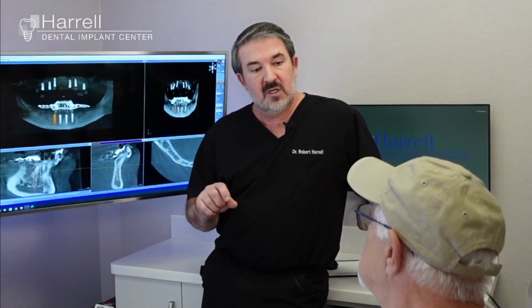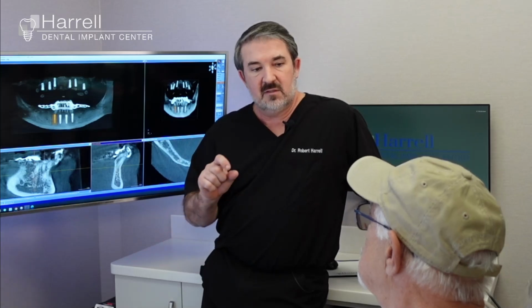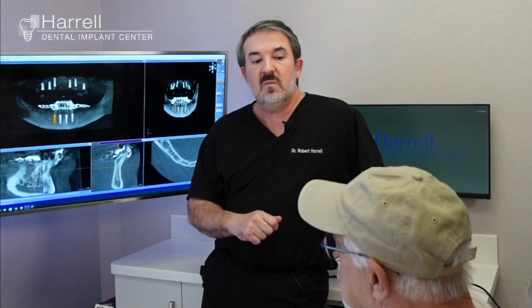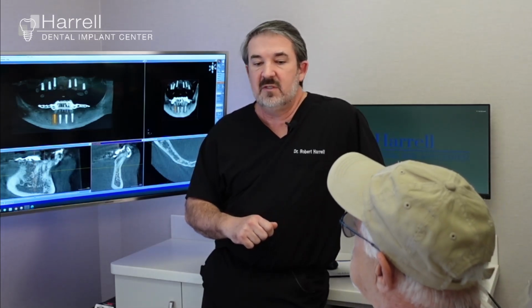Parts we can't see, we'll check the torque on all the abutments, and that's the piece that's attached from the implant to the teeth. And then we'll put in a new set of screws. That's just kind of normal service, like going in to get your oil change or your brakes done, just to make sure everything's running well.